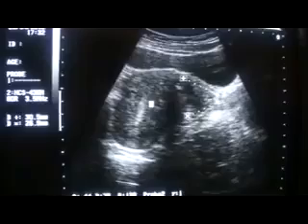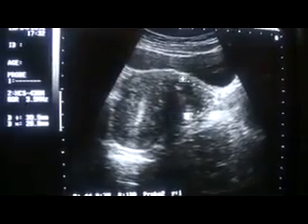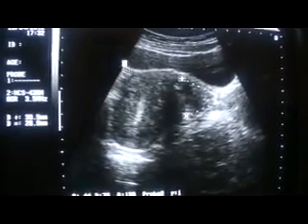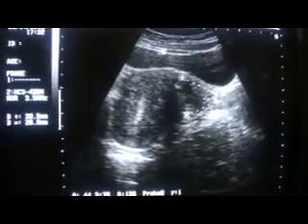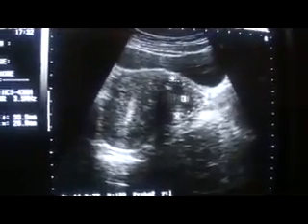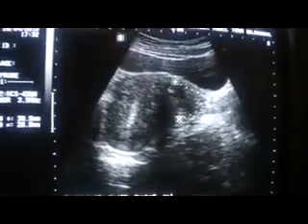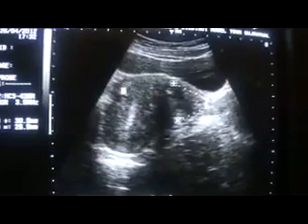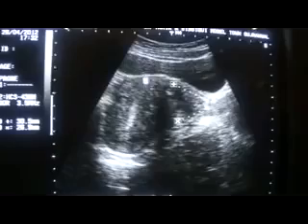Now when I move the probe at 90 degrees, here I am. Easily you can say, well, this is a fibroid, this area, this is a mass. This is not a mass, this is basically the fundus region.